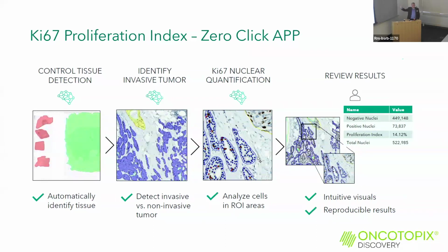And these can be used in those patient decisions. Those can be used and put into your data tables or whatever you need to do. They're also modifiable if you disagree with what the AI generates. And we've got a couple examples of these.